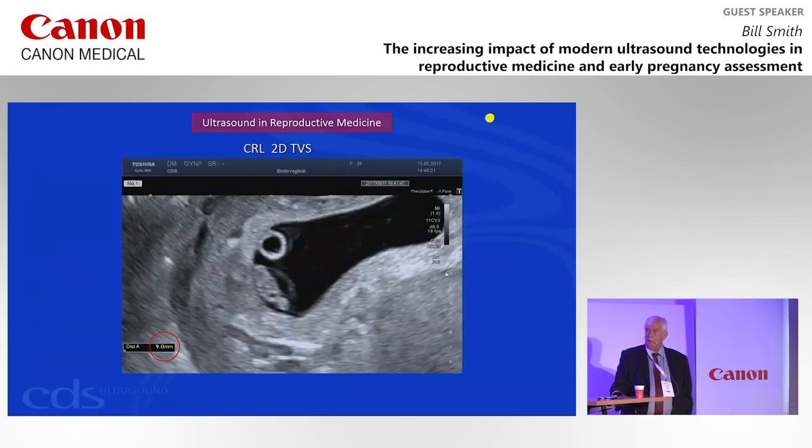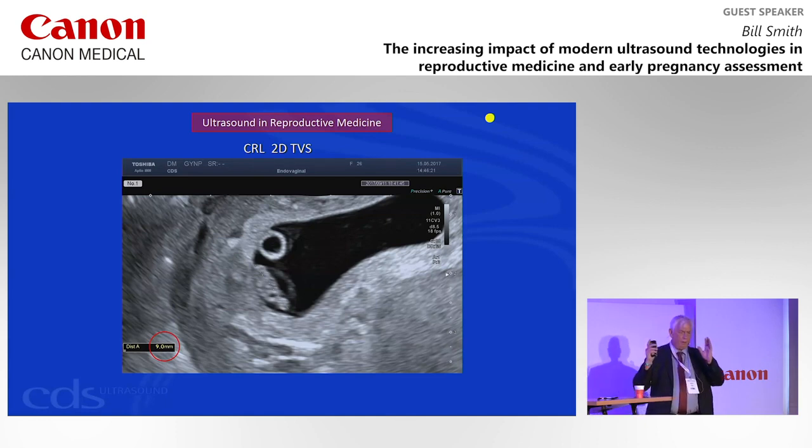Keeping on along with 3D and early pregnancy, we've got this thing about measurements. With this kind of imaging, we should be looking more at the ultrasound. Is that normal or is it not normal? A visual thing. But we have this thing about measurements.